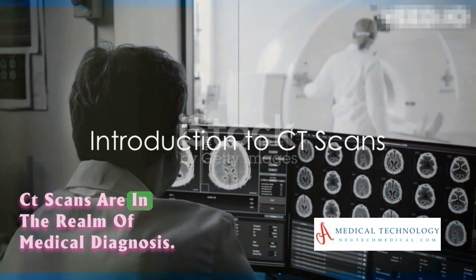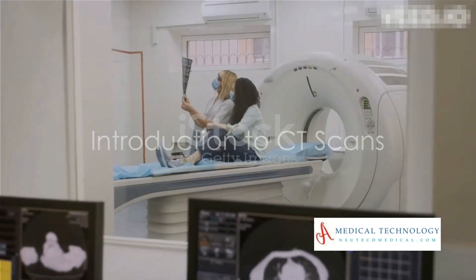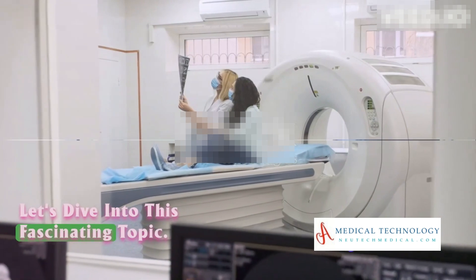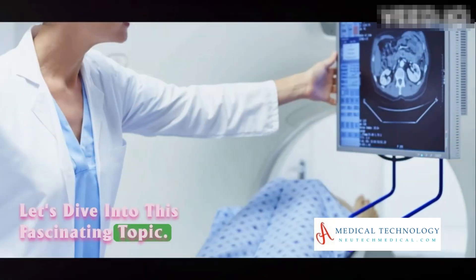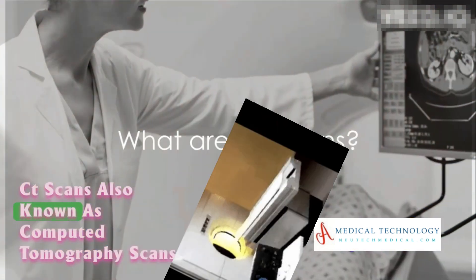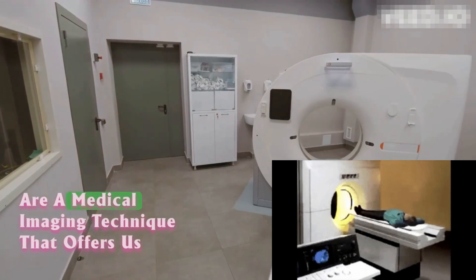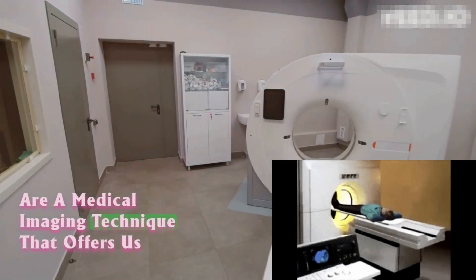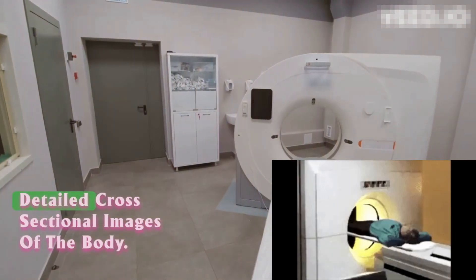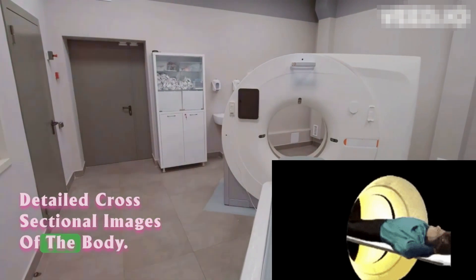CT scans are in the realm of medical diagnosis. Let's dive into this fascinating topic. CT scans, also known as computed tomography scans, are a medical imaging technique that offers us detailed cross-sectional images of the body.